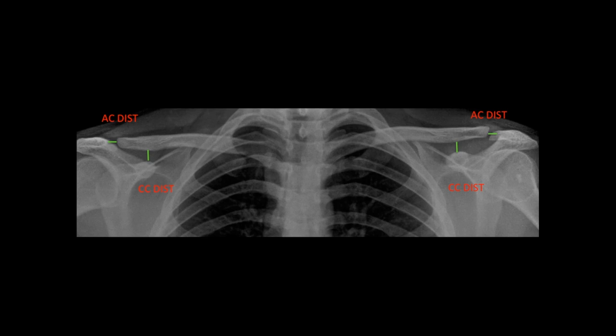In cases of AC joint sprain, weight-bearing X-rays can be performed where the patient holds weights in both hands. Normally in AC joint sprain the AC joint distance may remain normal at rest, but with weight-bearing X-rays there will be widening of the AC joint distance on the injured side — and that's how you can diagnose an AC joint sprain or lower-grade AC joint injury.